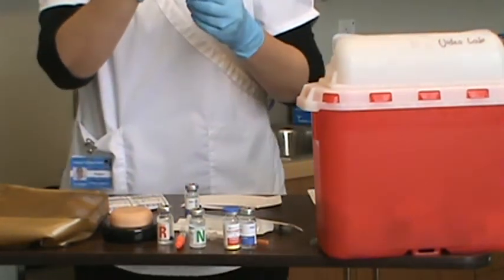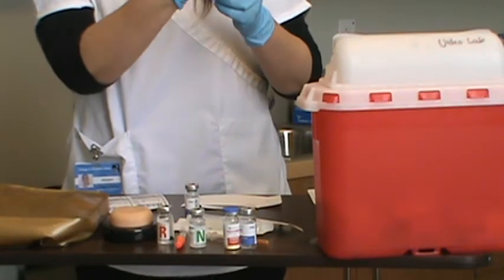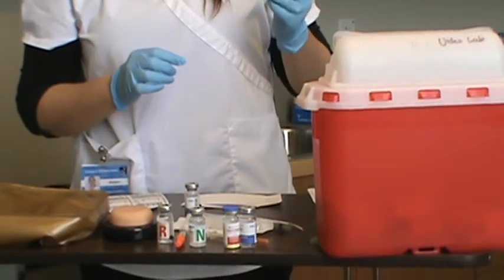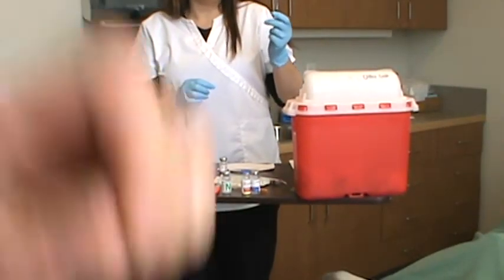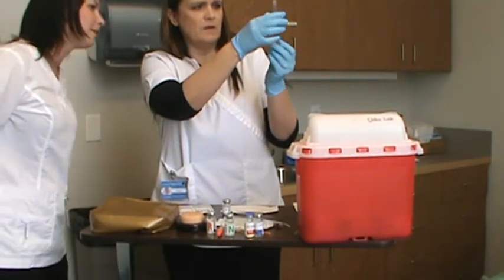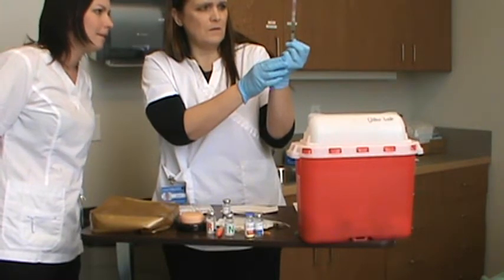And again, this is a high-risk drug, so I would have to show you, and I'm going to have to waste some. 1.5.